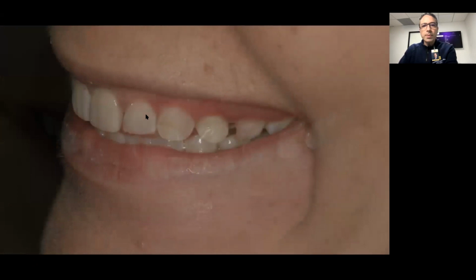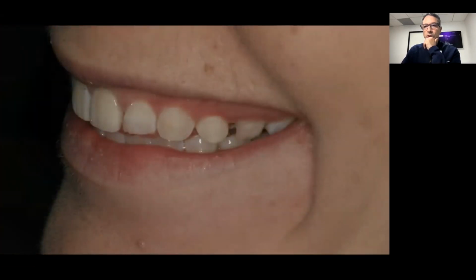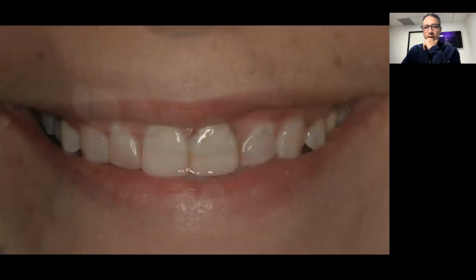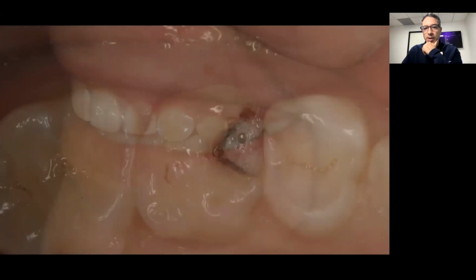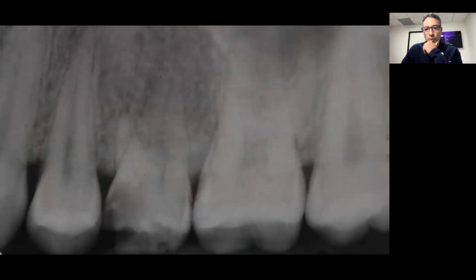Cool. So some patients here, let's play with diagnosis. Take a look at this photo. You're seeing a young patient with short teeth, more or less intact dentition except for some composite on the central incisor. And we're seeing a primary tooth that is decayed and non-restorable. Okay. Actually, I'm going to remove this tooth and replace it with an implant.